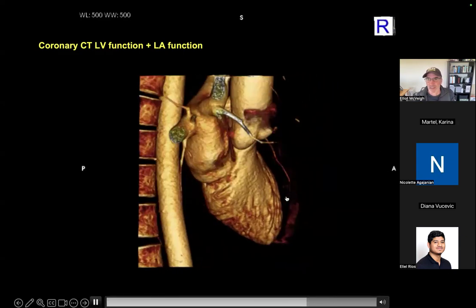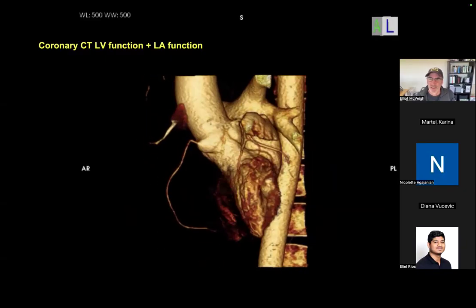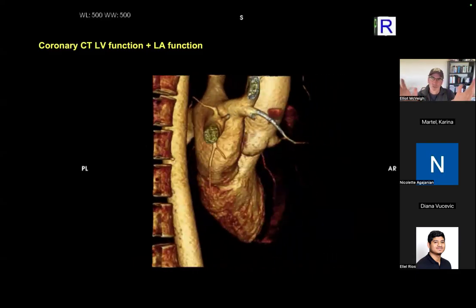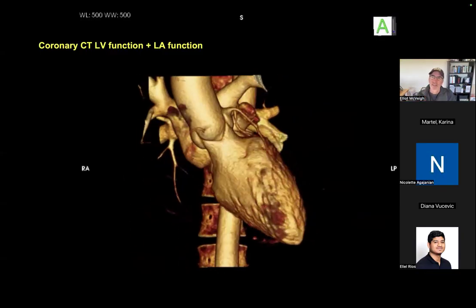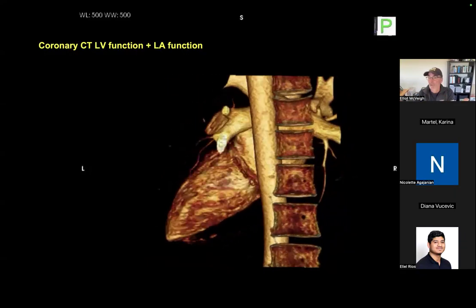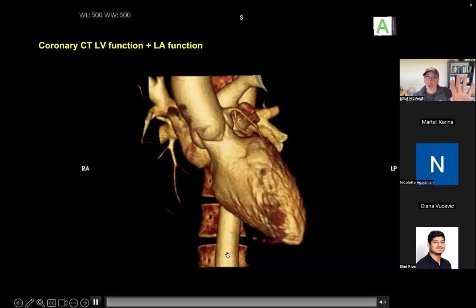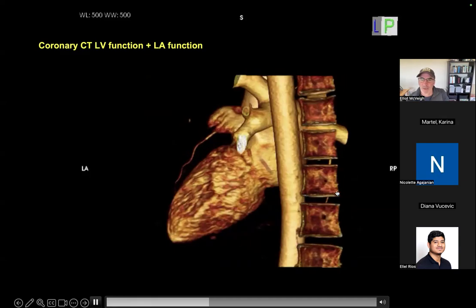This analysis for 3D, when you're looking at this movie, is done in a trivial way. All you do is cut away stuff that's around the heart. So you just quickly cut away the stuff outside it, and then you threshold the pixels so that only those pixels above a certain amplitude will show you any kind of signal, and then you render that. And so all of the interfering signal that is below the value of the contrast agent goes away. It becomes transparent.